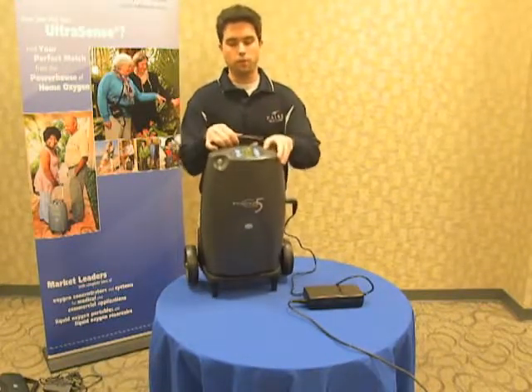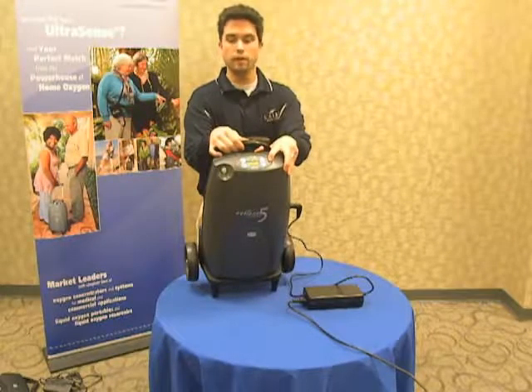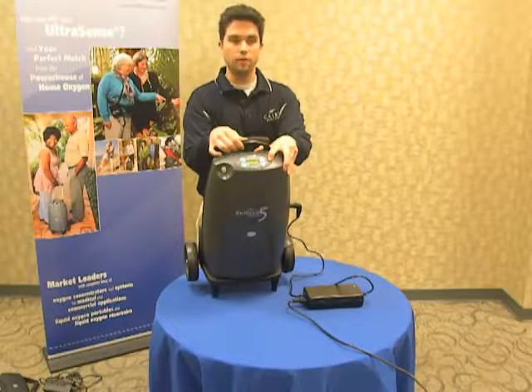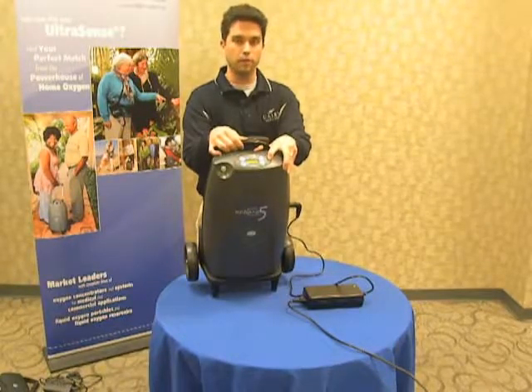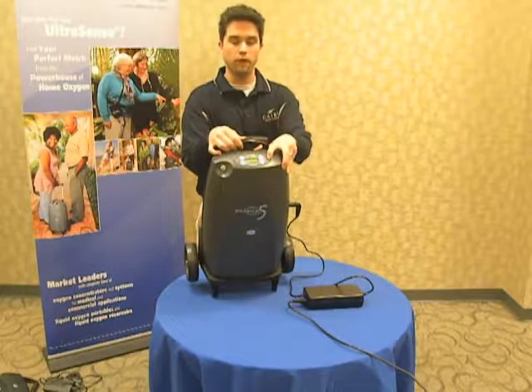One thing that you do want to look for is to the side of the plus and minus buttons on the Eclipse, there is a green light shaped like an electrical plug. If this light is lit up, that also lets you know that the Eclipse is running from external power. Be it AC or DC power, you'll need to look for that light.